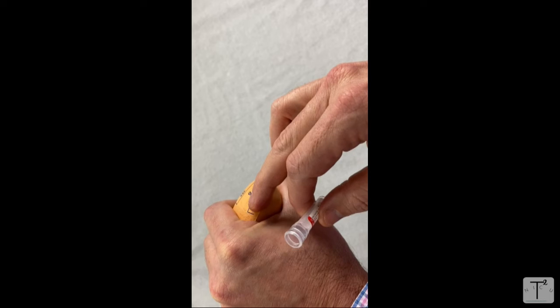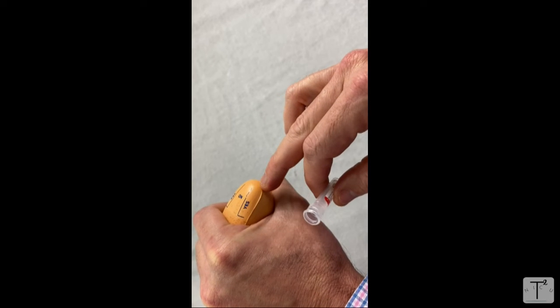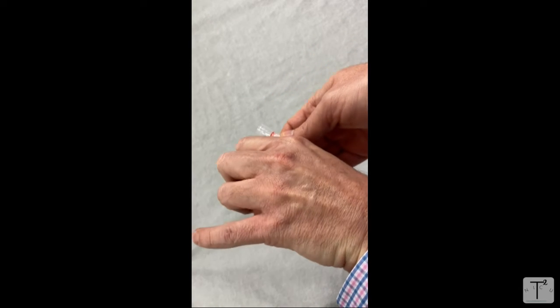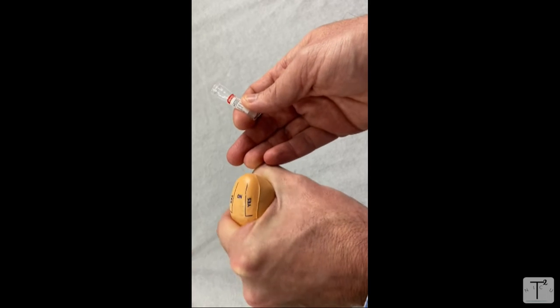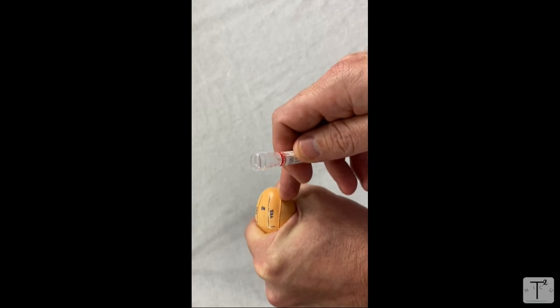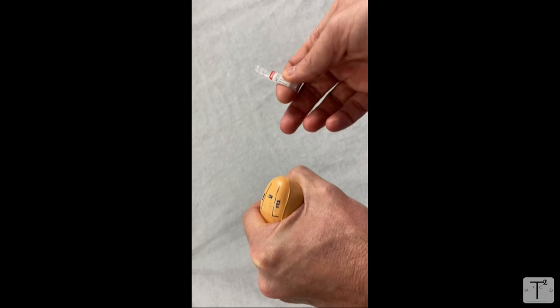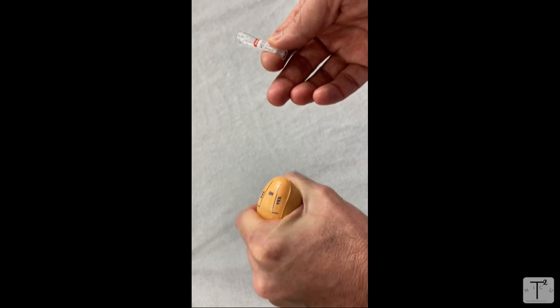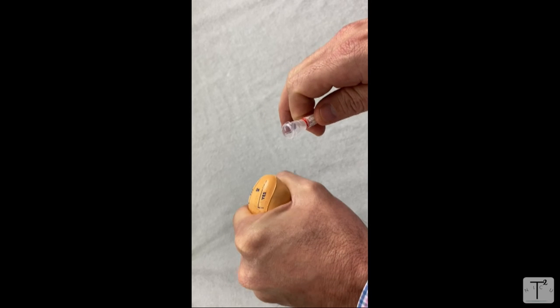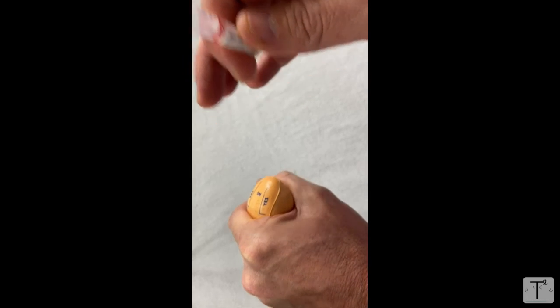These vials without a scoop are a little more challenging — you have to capture the drop differently. This foam figure is actually a good replica of the actual foot. A common mistake is holding the foot way up above heart level — you're squeezing, getting no blood, so you squeeze harder, occlude, and then your lab values are altered. Remember the five things: warm your heel, know your landmarks, let the heel refill, do two good squeezes, capture the drop, wipe your heel, let the heel refill, let gravity work, and control your drop.